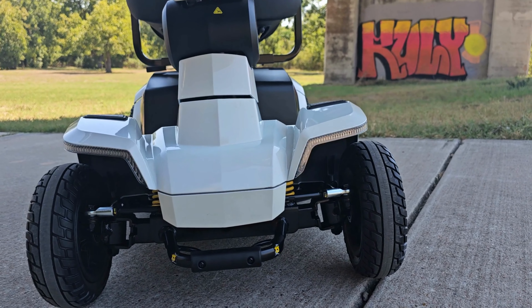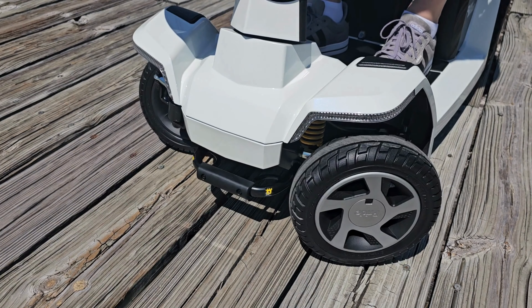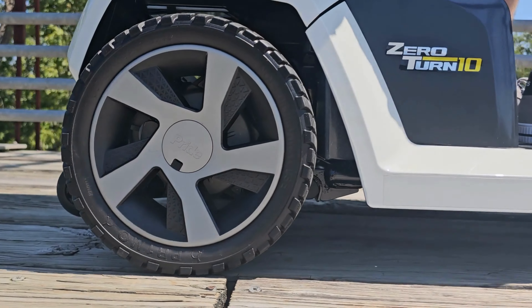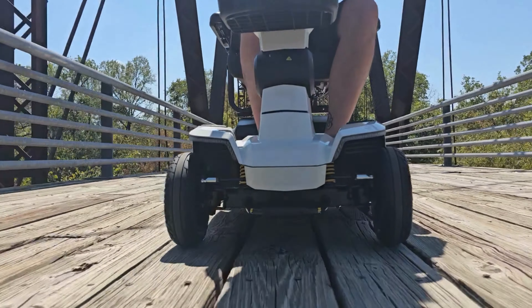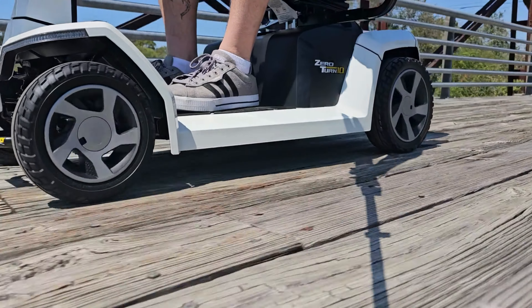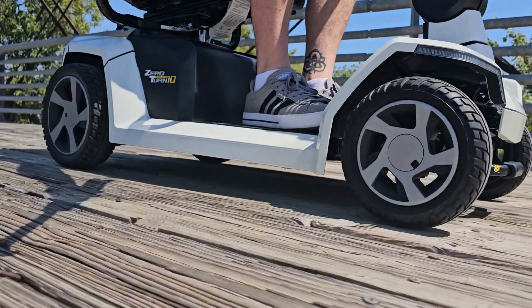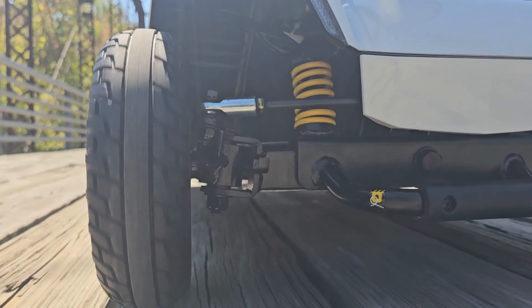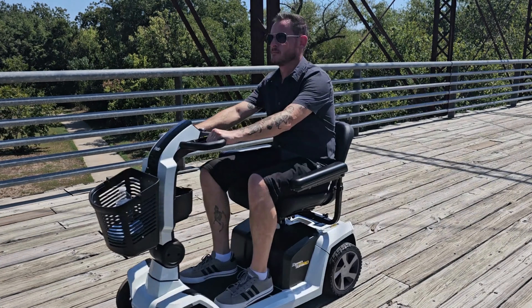When you're done spending time outdoors, the Zero Turn 10 transitions seamlessly indoors — maneuver smoothly through halls and doorways with i-Turn technology. Featuring a weight capacity of 400 pounds, up to 17.9 miles per charge, and a top speed of seven miles per hour.